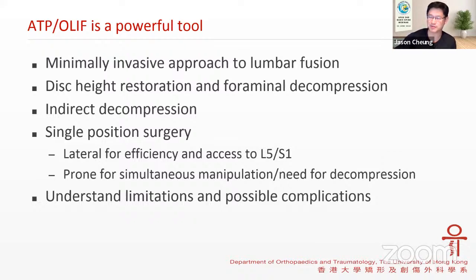With the trend for single position surgery, I think it's very efficient, with access to L5-S1. And in the prone procedure, you can allow simultaneous posterior manipulation, especially in cases where you have a posterior direct decompression. But always understand your limitations and the possible complications that arise through these procedures. There is a learning curve, but once you've dealt with a good number of lateral procedures, the prone procedure is just a step up and not too difficult.